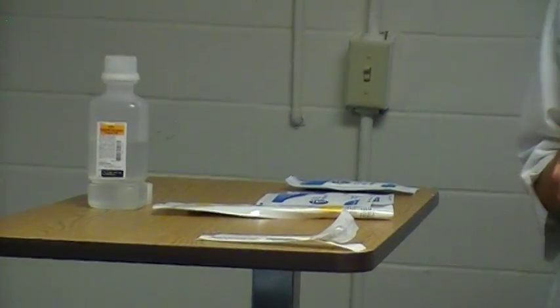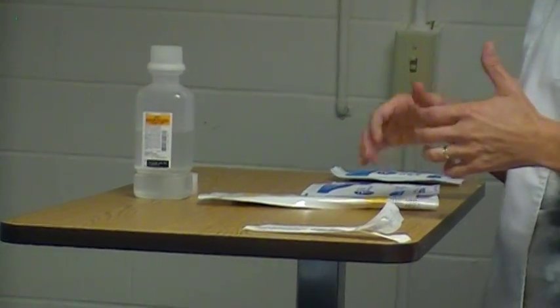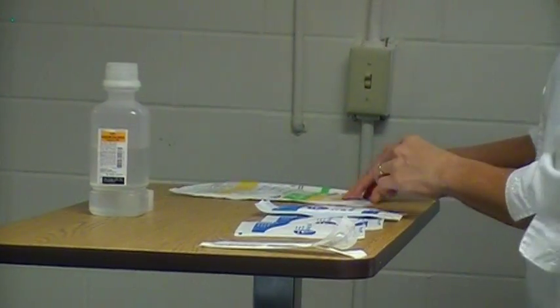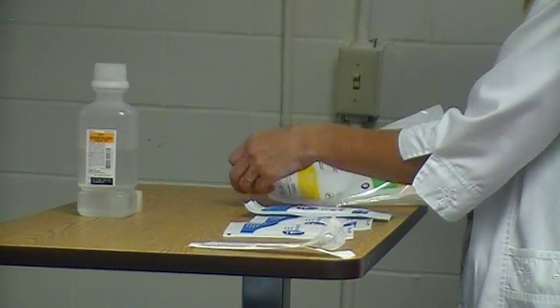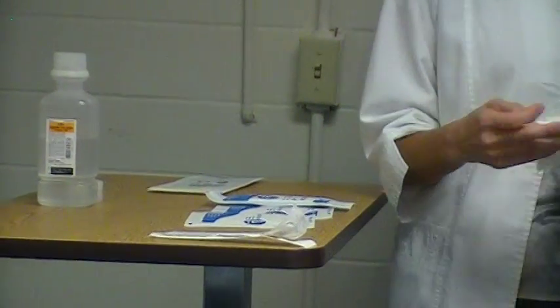The easiest way to do this is to have everything in order of how you are going to need it. So, the first thing that I'm going to do is I'm going to open up my packages that I'm going to use. My gloves will be put on in just a minute after I've gotten everything ready, so I'm going to set them over here to the side.